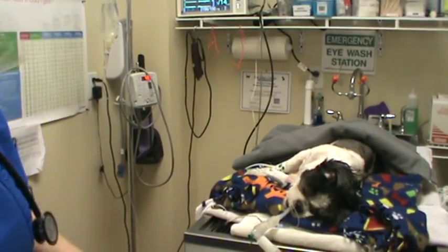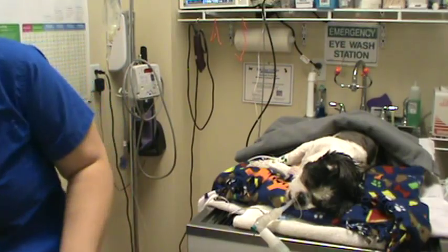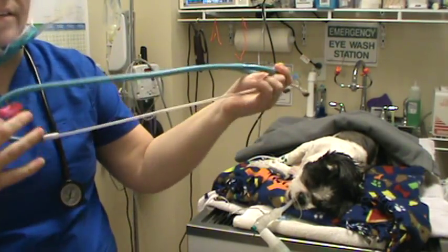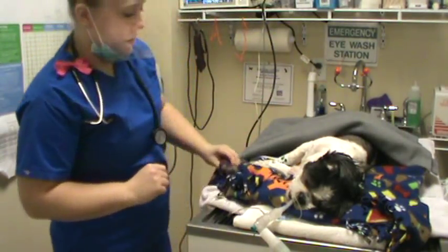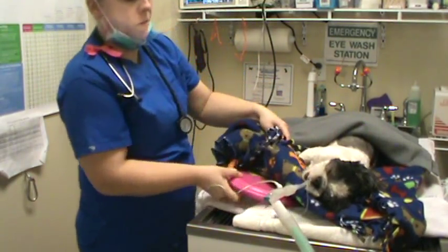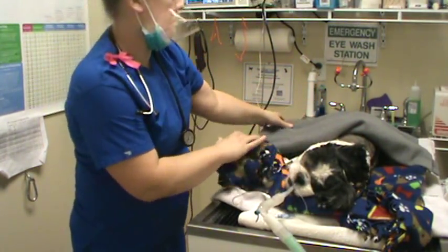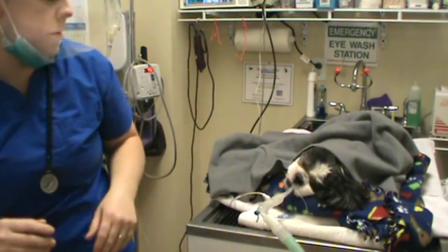We're not going to use a temperature probe — we'll just use a rectal thermometer. I have my stethoscope here and also the esophageal stethoscope if we need it, to demonstrate how that would work when we get into our dental procedure. She's also on a bunch of little pink warming discs underneath her fleece to keep her warm — we have three of those, plus a little pillow under her bed and fleece on top, to prevent hypothermia.